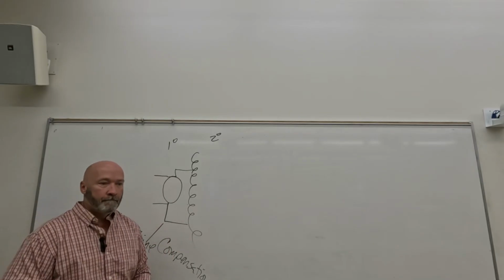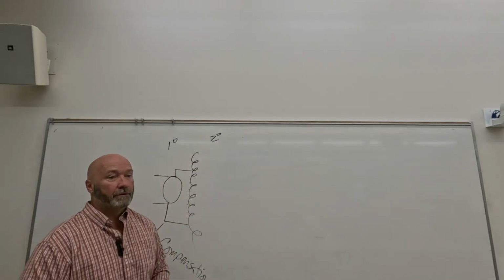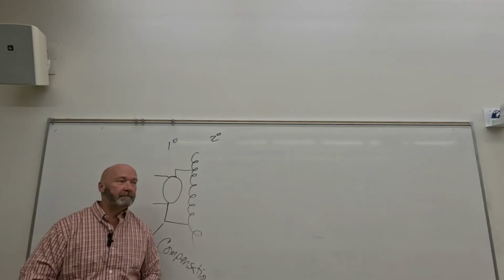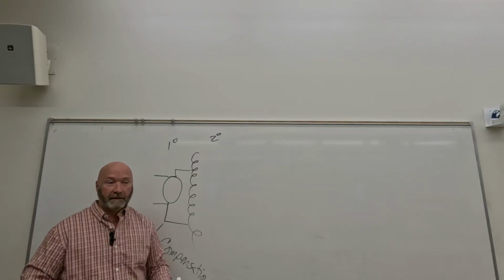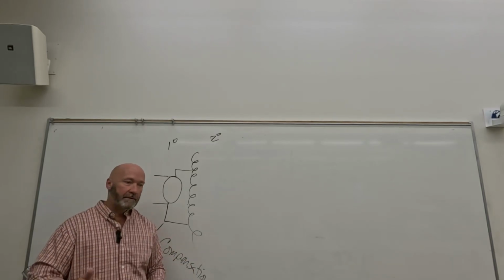Would you say that the ranges are the same for Mammo and X-ray? No. The Mammo machines, the maximum kVp is probably 50 in Mammo. The Mammo machine is totally different than X-ray. I mean, the construction appears to be the same, but the target material is different.